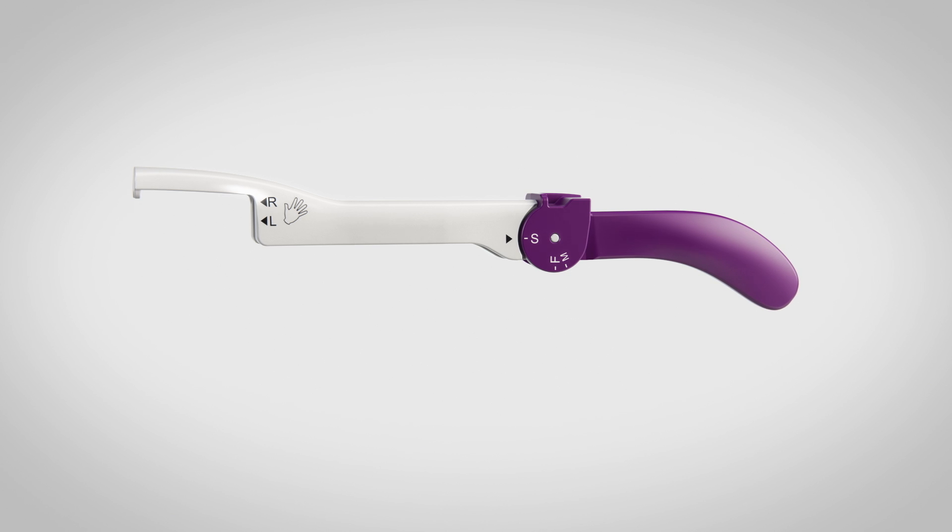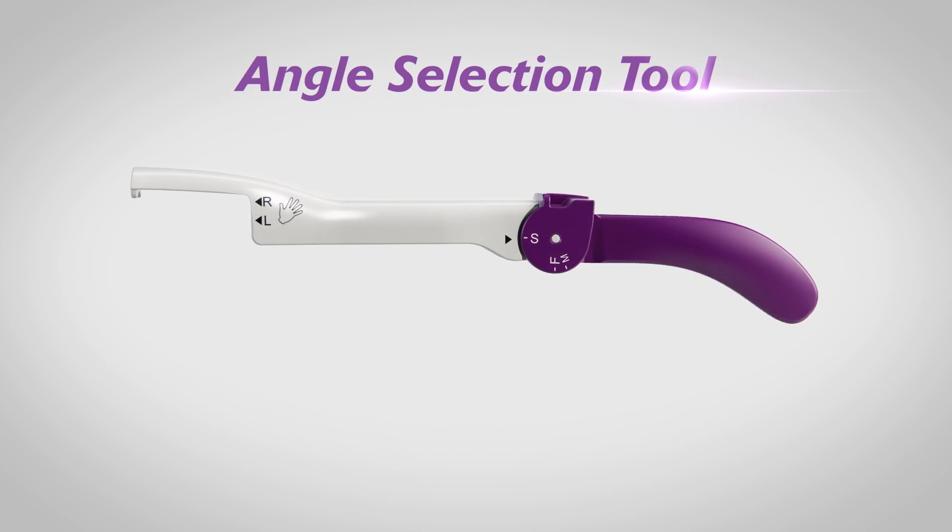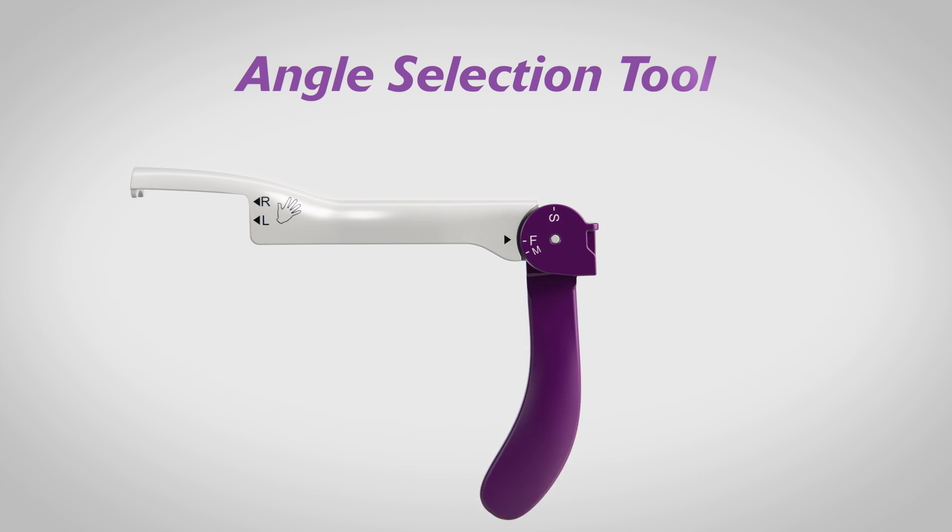The Relieva Scout Multi-Sinus Dilation System includes an angle selection tool that enables predictable bending of the seeker-like tip.